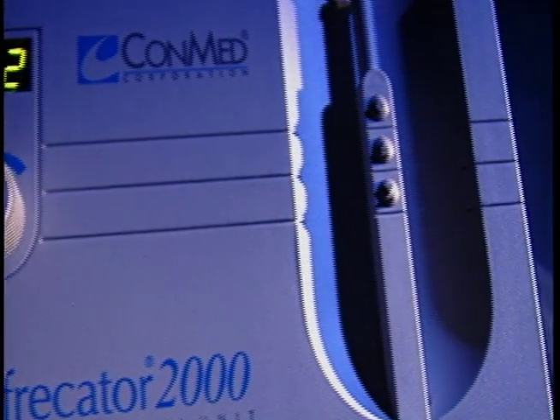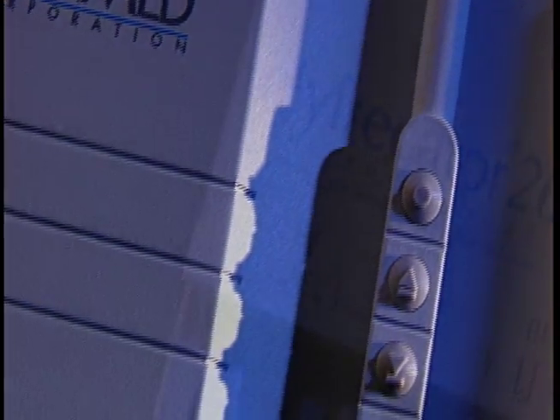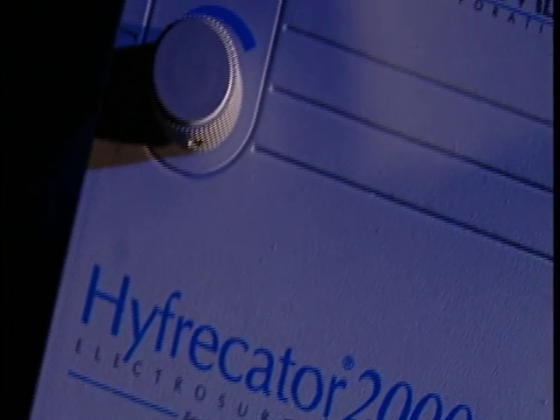There is only one Hyfrecator, the ConMed Hyfrecator 2000 — accept no imitations. The ConMed Hyfrecator 2000 is the number one choice among physicians performing desiccation, coagulation, and fulguration procedures.